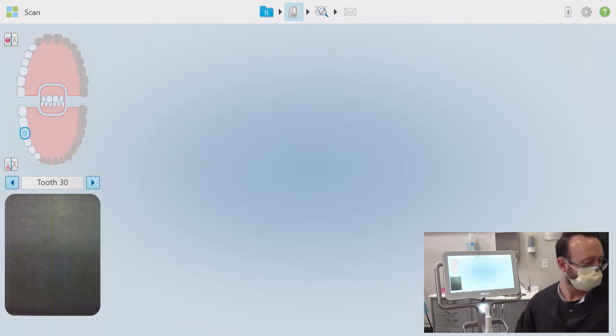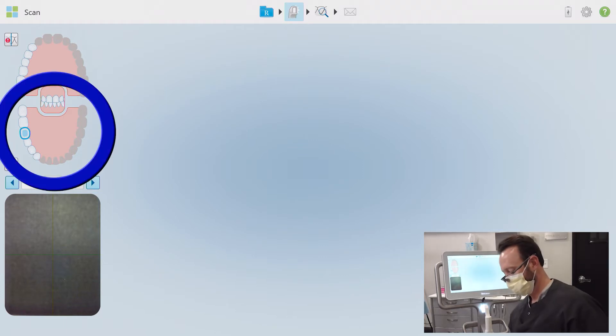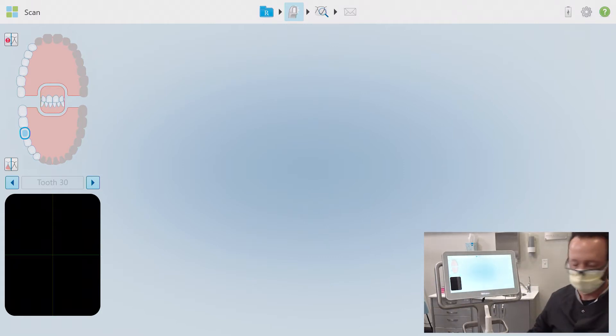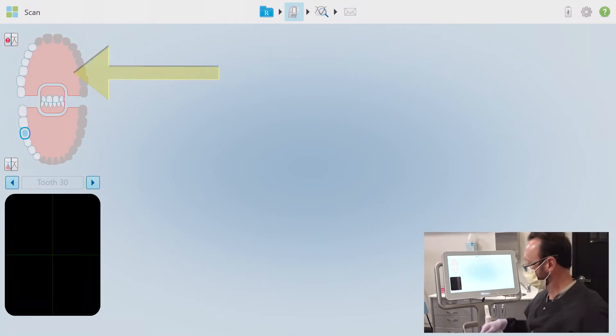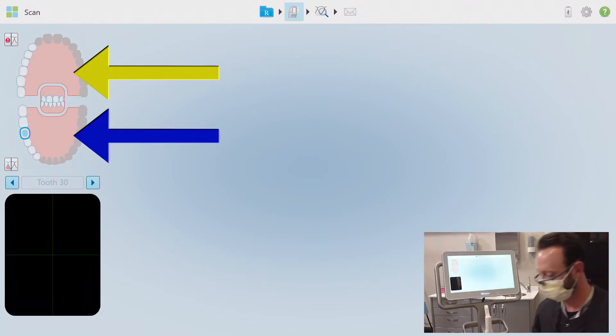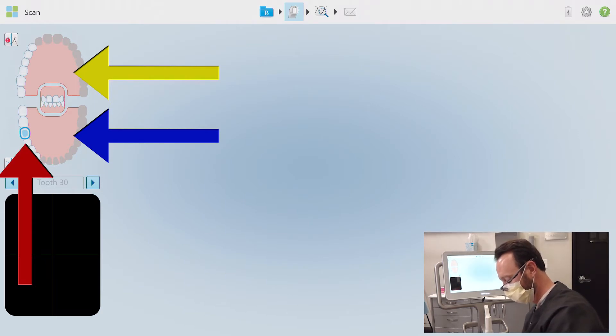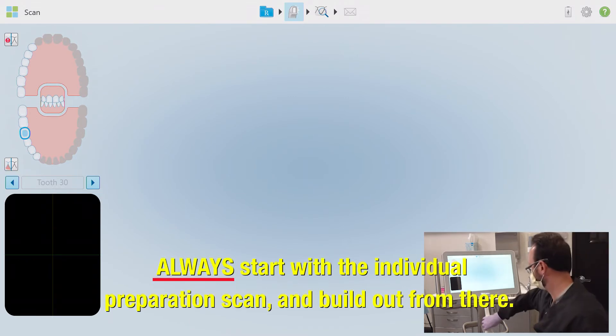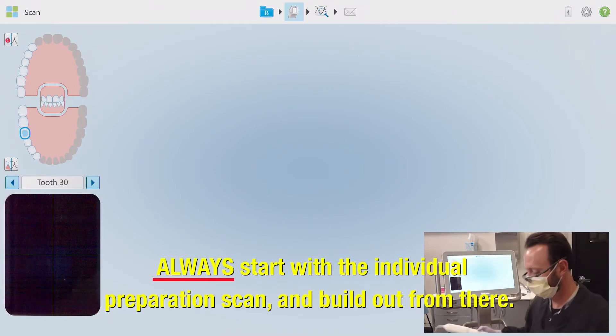In cases where the preparation is the most posterior tooth in the arch, it will still be a good idea to capture a full arch scan just like you would while taking a physical impression. The idea here is to prevent a simulated bite collapse and poor occlusion on the final crown. I have a few selections as to where I'd like to scan first — I could begin with the opposing arch, the working quadrant, or even the actual tooth preparation. Even though the unit will let you start at any of these options, always start with the individual preparation scan and build out from there.